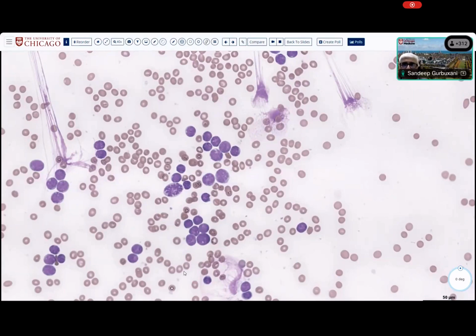And the next question would be, the smudge cells, no, they are very preserved cells. You can see the cytoplasm in almost all of them. Does anybody want to venture a guess as to what type of blast these are? And then I will go to higher magnification on the still. Lymphoid. So very good. Yeah, excellent.